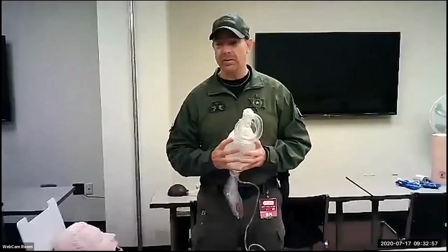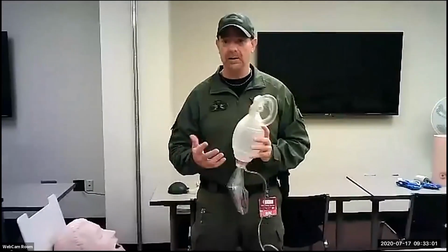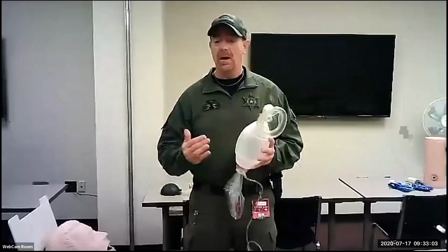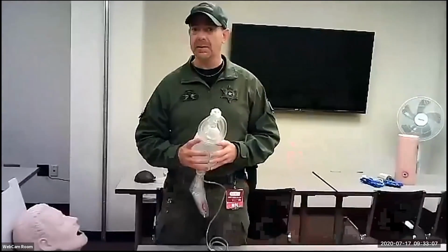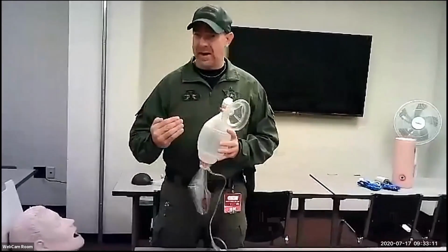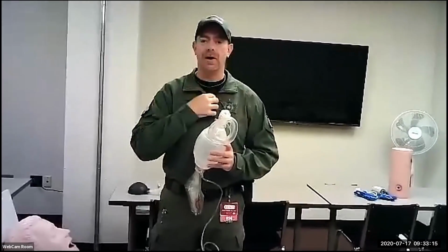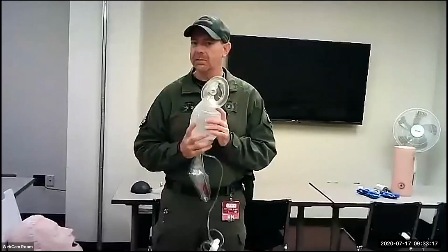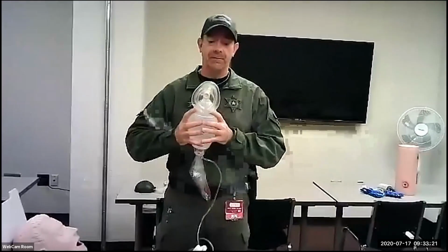The first time you do this on someone, you're going to be nervous. You're going to be scared to death. If you're doing ER rotations, it's really not in a controlled atmosphere. If you're pre-hospital, doing that type of medicine, it's in a really uncontrolled atmosphere. So I need as much time as I can. I'm replacing that nitrogen that sits in my mouth and my trachea and everything else with 100% oxygen. So we're denitrogenating.